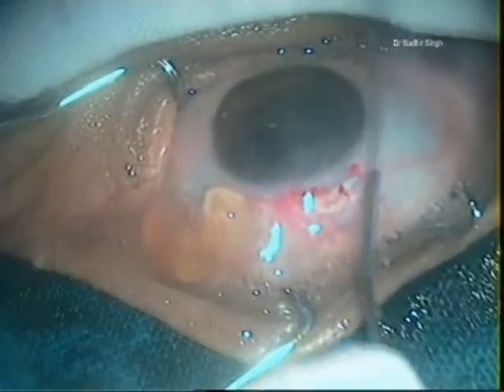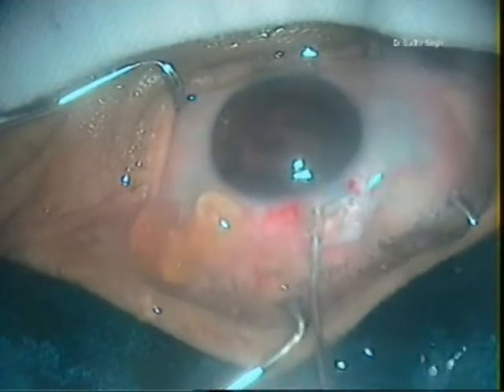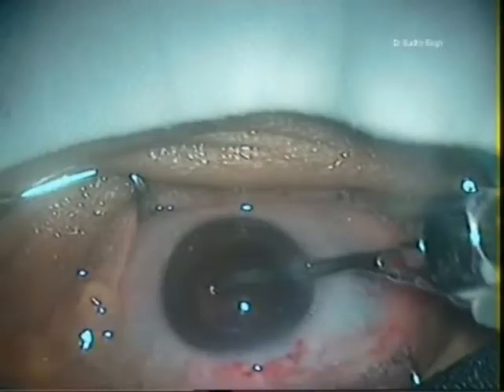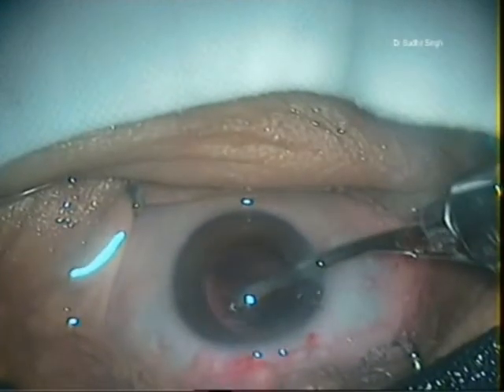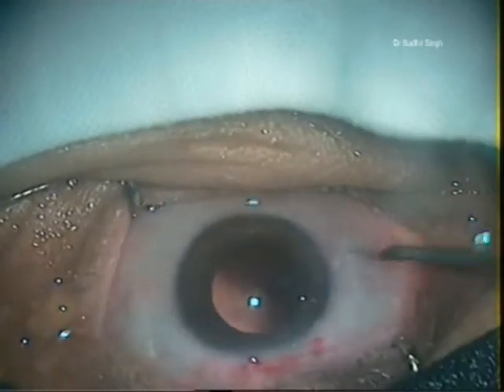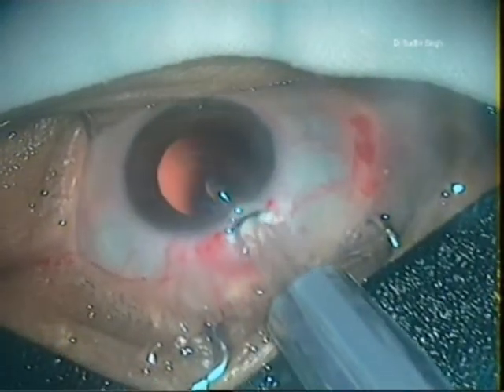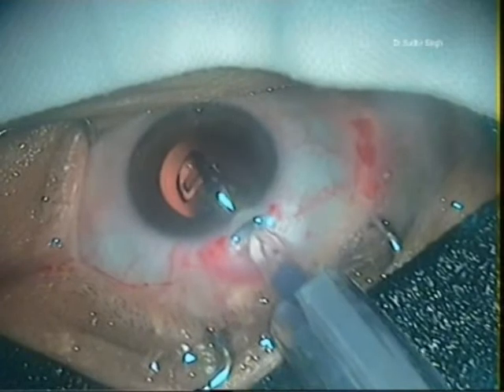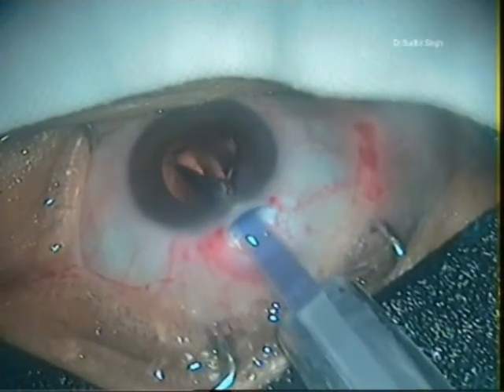The remaining cortical matter cleanup is done with a direct 23-gauge Simcoe irrigating aspirating cannula. Aspiration should be done from the side port only, as the anterior chamber remains deep. The anterior chamber is formed with viscoelastic. A single-piece foldable intraocular lens is implanted into the capsular bag.